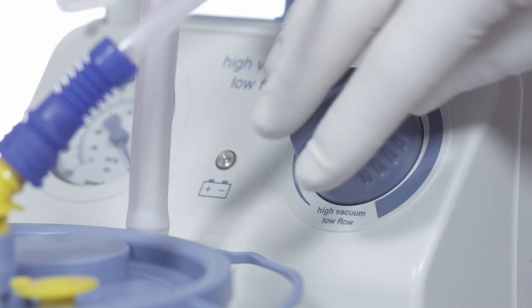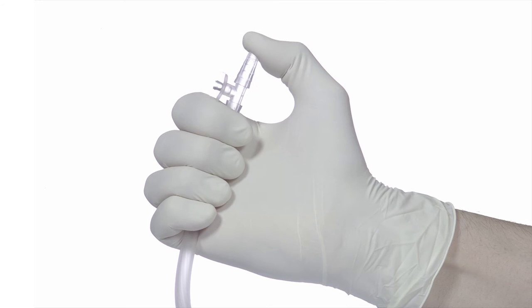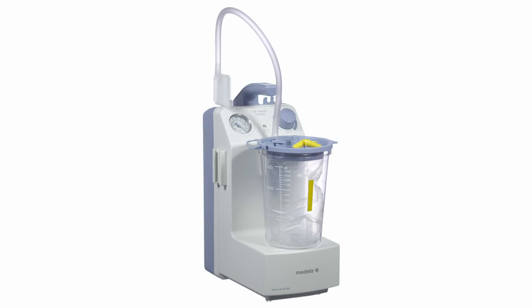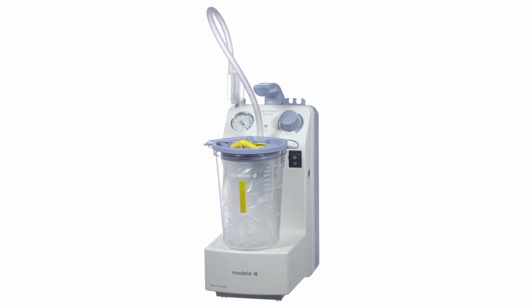Set the maximum vacuum by pressing the knob, turning it to the right, and clamp the tubing. Compare the vacuum levels with the chart in the instructions for use. When the values match, the pump is ready for use and can be equipped with the yankauers or catheters necessary for your desired application.